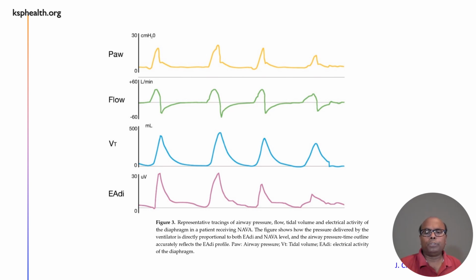The amount of flow and tidal volume is generated based on EAdi. So it is very advantageous as far as patient-ventilator synchrony goes, and also for lung protective ventilation. These two modes definitely help with VILI, ventilator-induced lung injury.